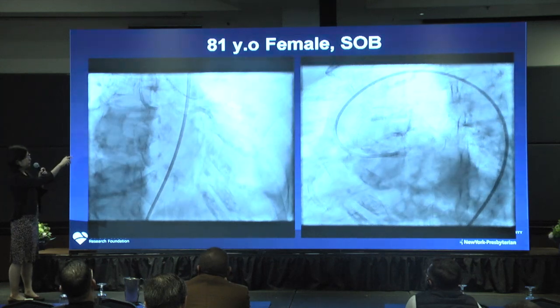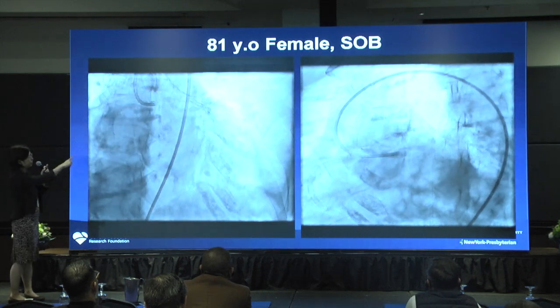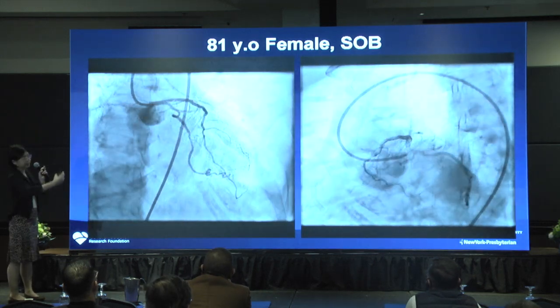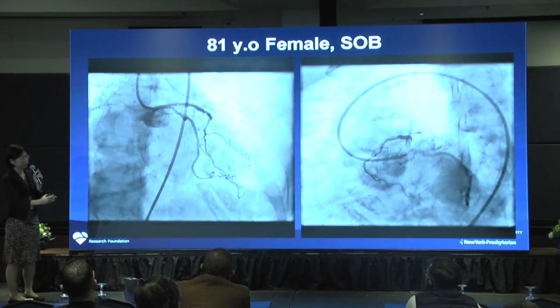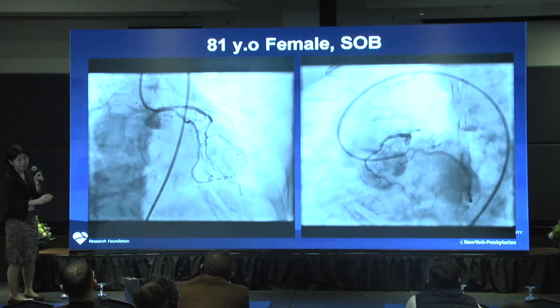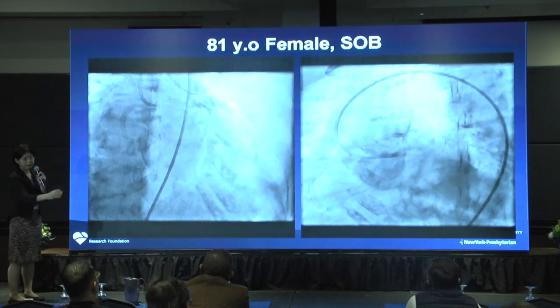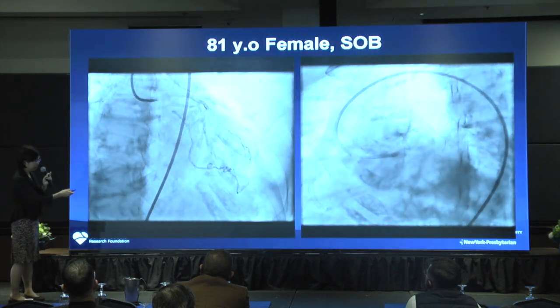So this is a left main. Actually, we thought the main lesion was the proximal LAD. You see the proximal LAD has something funny, a slit, and the ostial LAD too. And the circumflex looks okay. And the left main, we don't feel this is super significant. Those are the findings, but it looks very calcified. And then we did the IVUS.